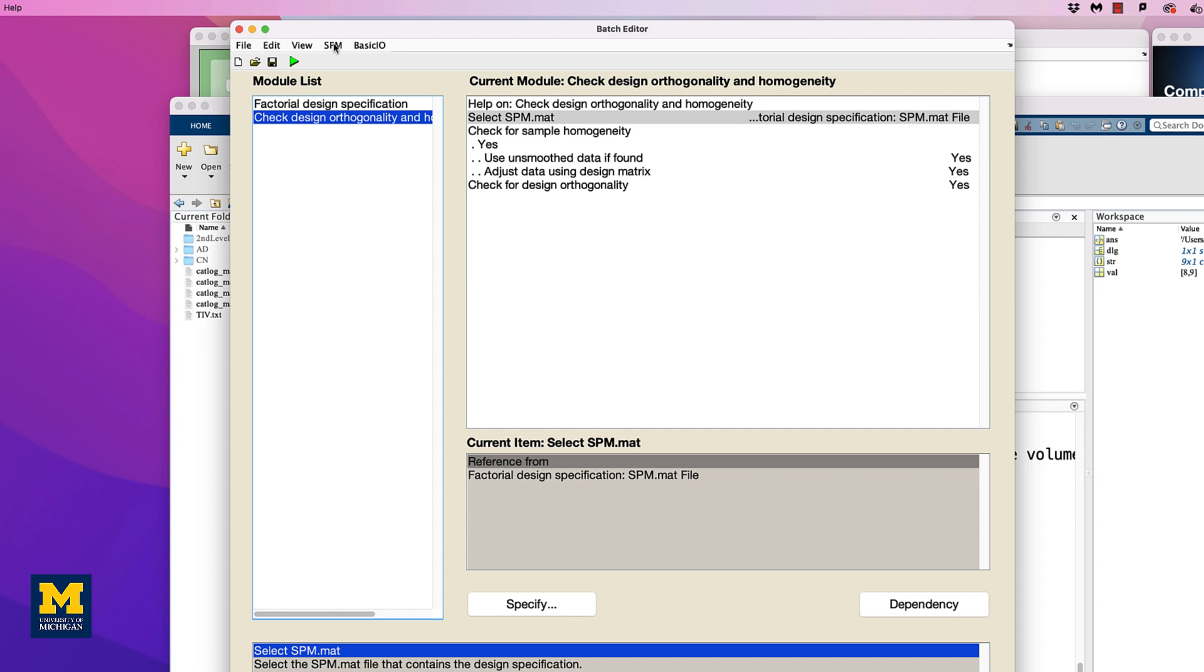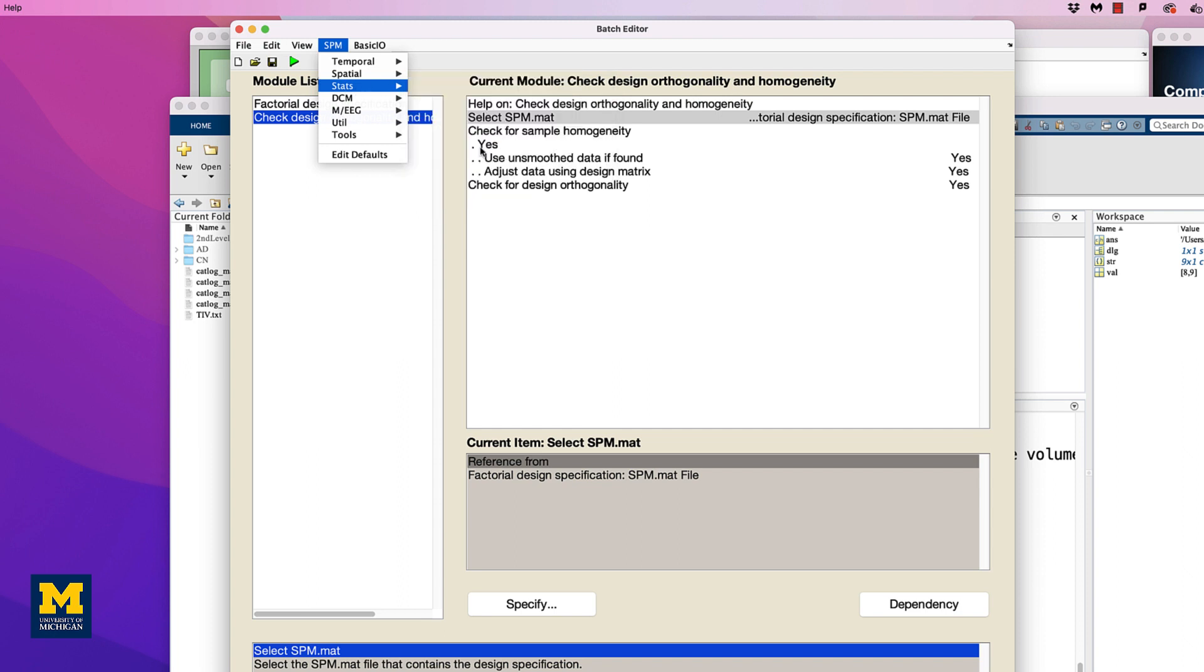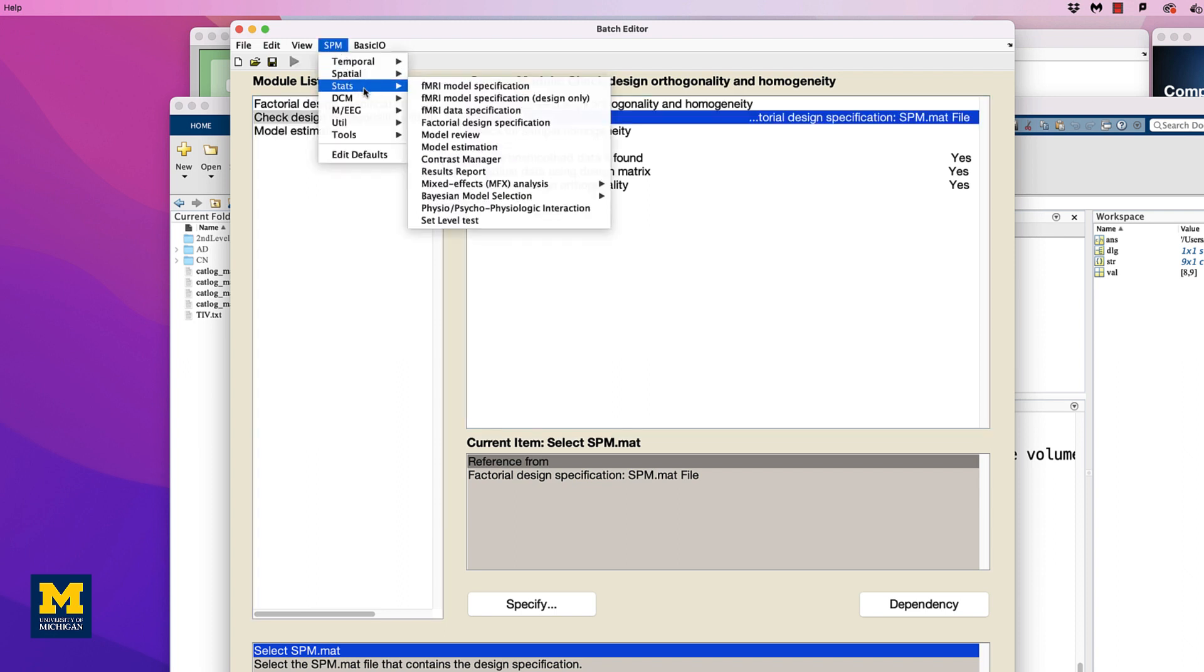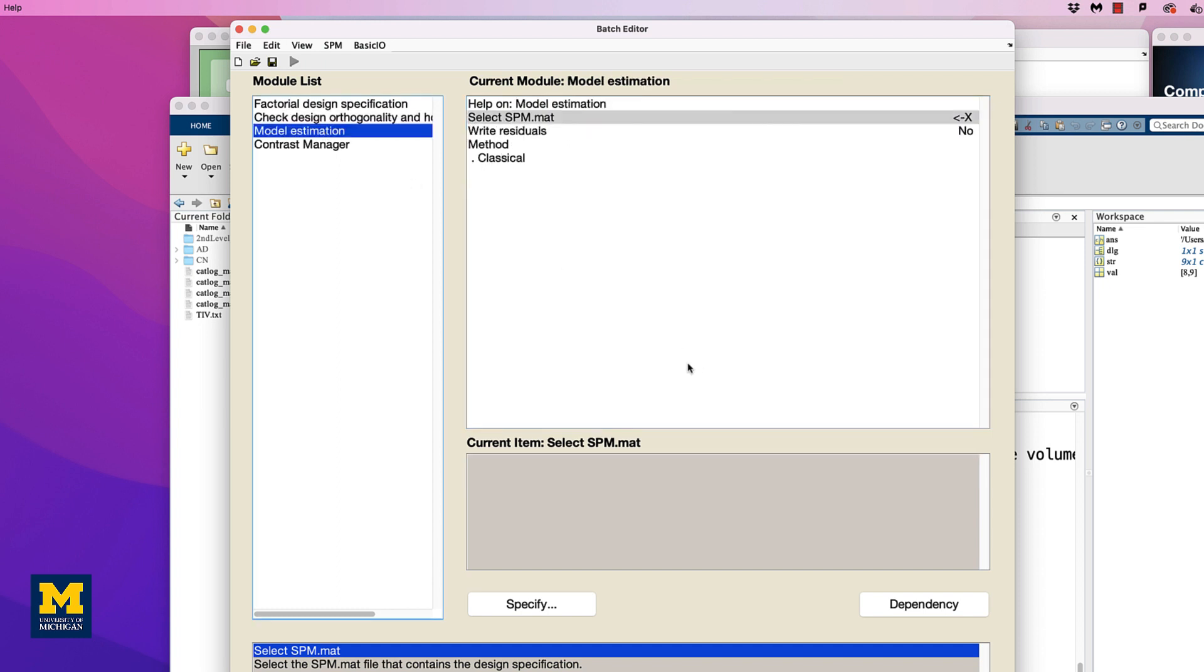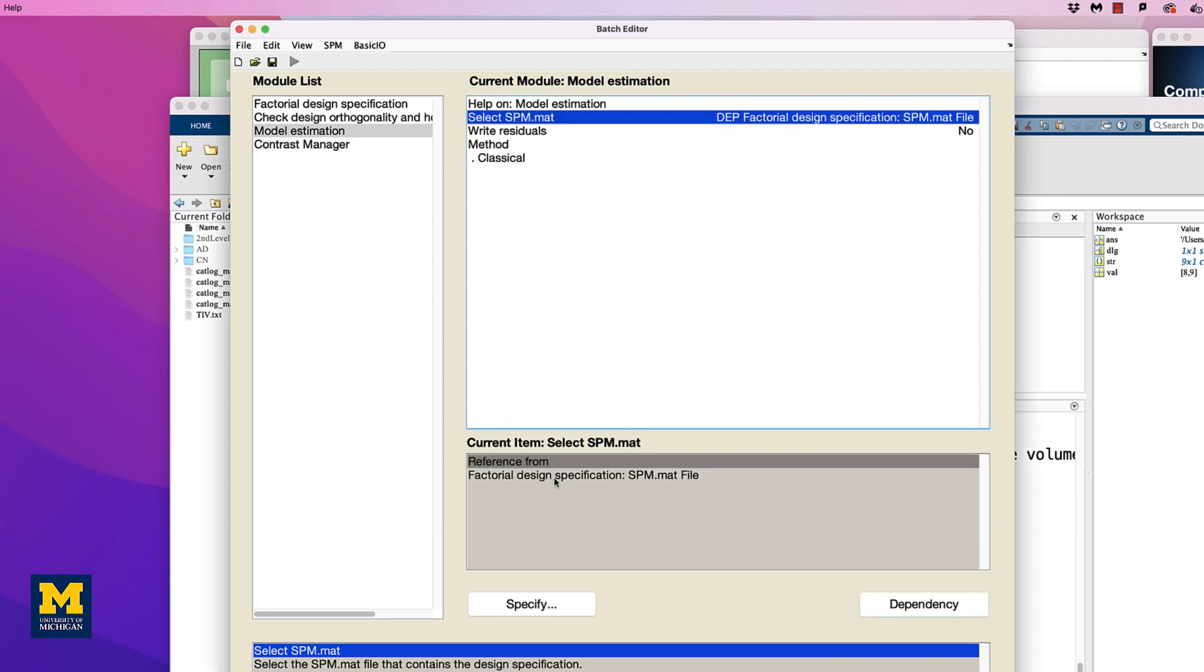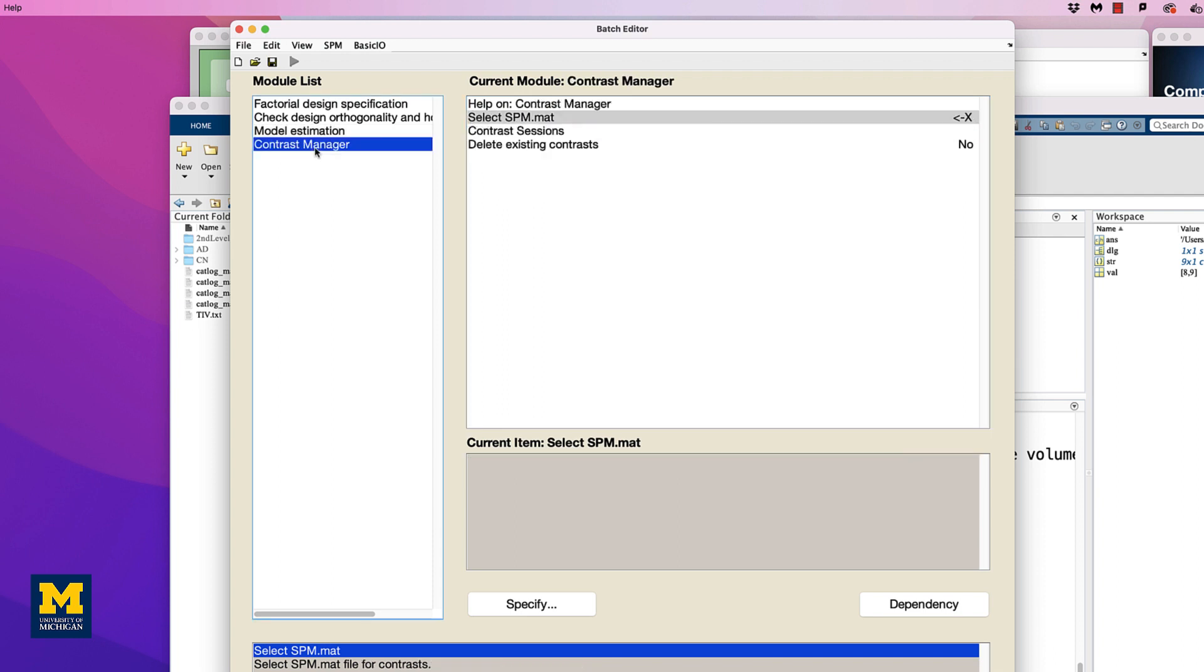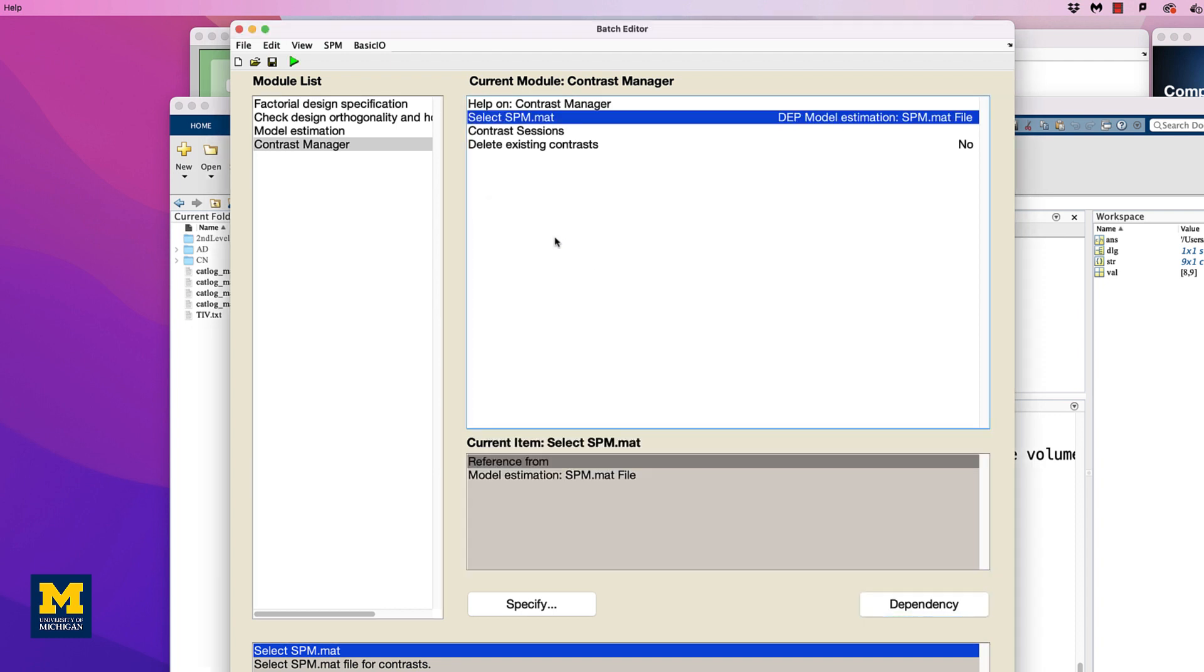You can also save time by adding two additional modules, one to estimate the model, and one to generate the contrasts. In the menu at the top of the Batch Editor, click SPM Stats Model Estimation to add this module to the list. Then click on SPM Stats Contrast Manager. Click on the New Model Estimation module, highlight the Select SPM.MAT field, and then click on Dependency in the lower right corner of the Batch Editor window. Select the SPM.MAT file dependency from the Factorial Design Specification module. Similarly, click on the Contrast Manager module, highlight the Select SPM.MAT field, and click the Dependency button, selecting the SPM.MAT file from the Model Estimation step.